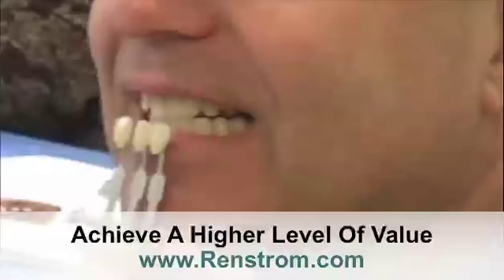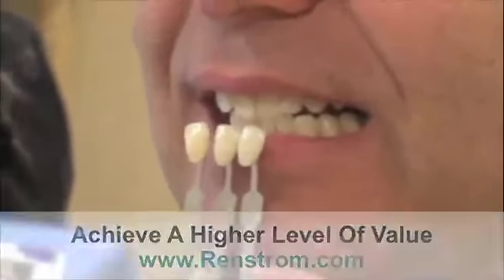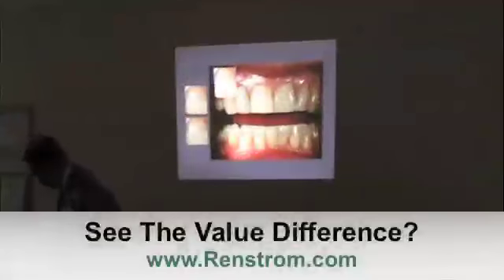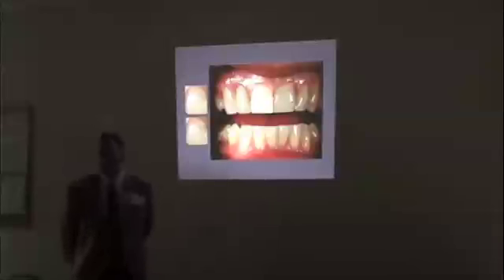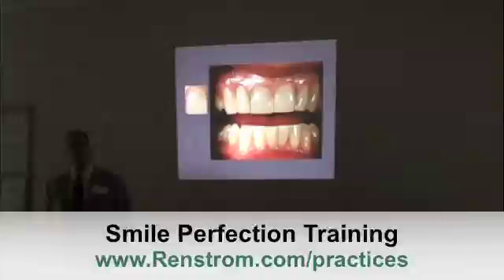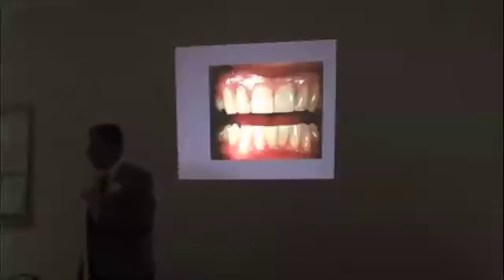The reason I show the guy like this is that in most offices you find the guy who got in between a 1 and a 2. Well, that's what I got. That's what I got too. Just shout out what you think. Good, light, dark, what do you think? Too light. You can see it, can't you? Okay, let's try the next. Here's number 2. Too dark? Yeah. Okay. Those three crowns are all half a value apart.